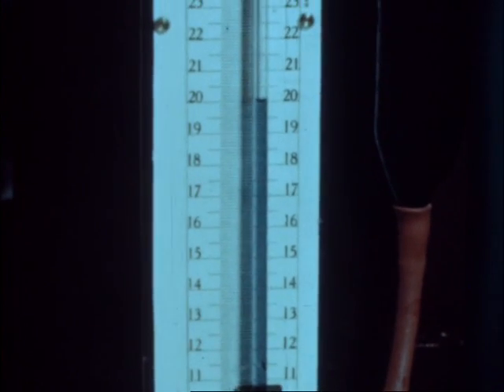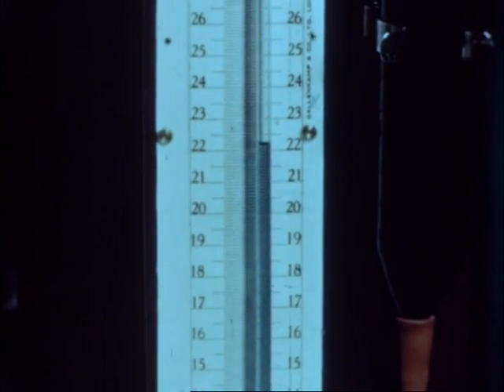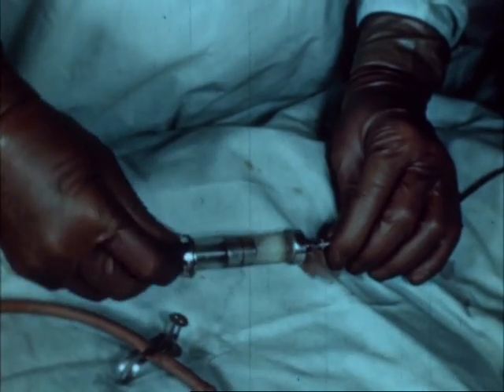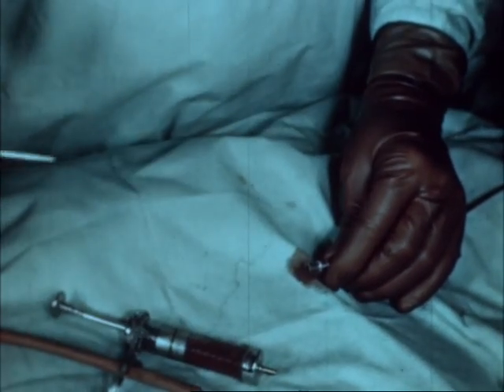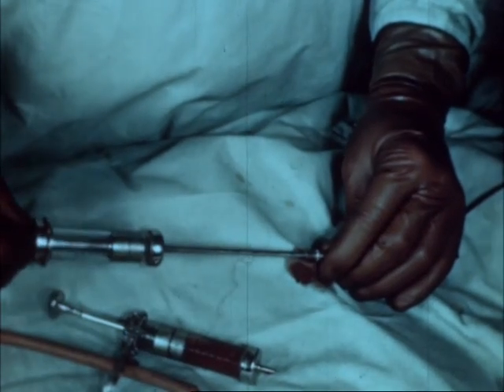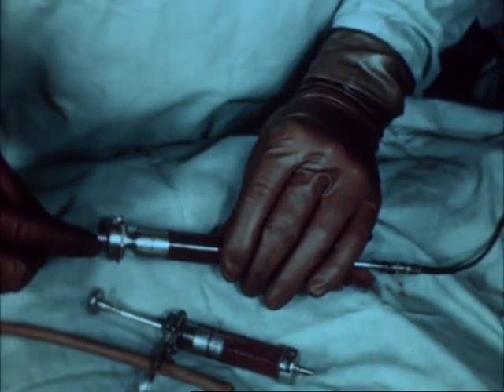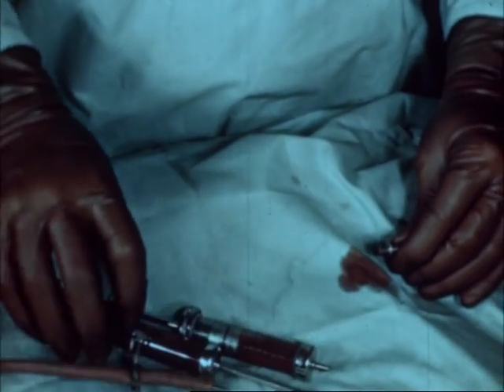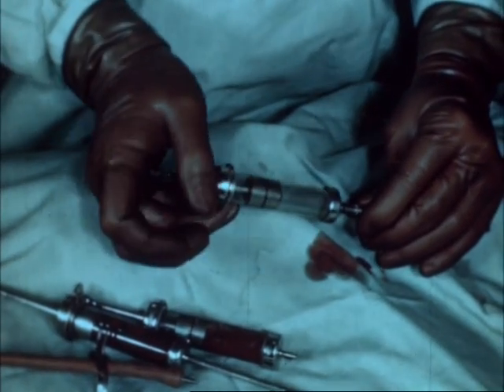For cardiac output estimations, samples may be withdrawn from any of these 3 positions in the right heart: right atrium, right ventricle, or pulmonary artery. In taking samples, the manometer connection is detached from the catheter and enough blood is withdrawn by a syringe to clear the catheter of saline. A change is then made to a special sampling syringe containing liquid paraffin, into which right heart blood is drawn. The catheter is then cleared by washing through with saline, and the manometer is reattached.